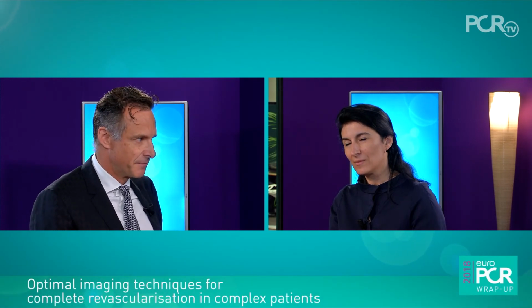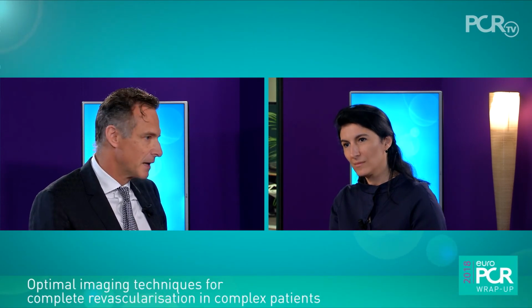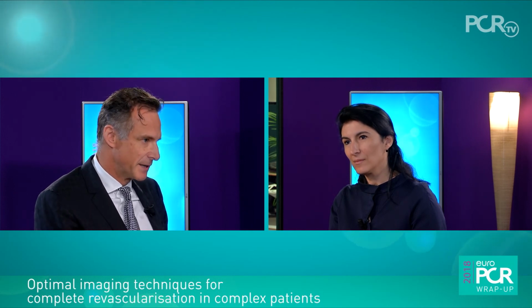And why do you think the MRI is so underused today? Well, some of the patients have symptoms and a normal LV function. If the symptom is clear angina and the LV function is normal, I think there's no reason to do it. That's one of the reasons.